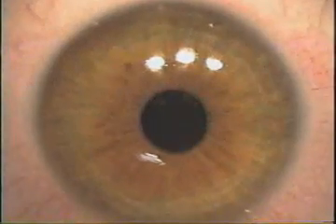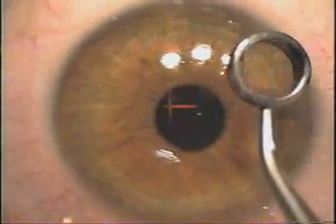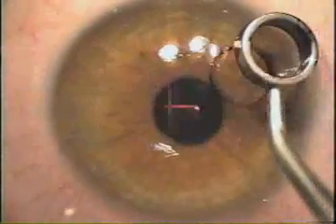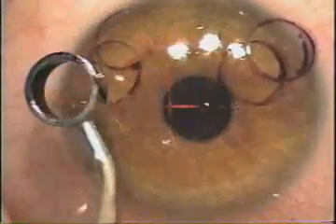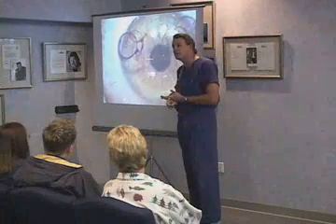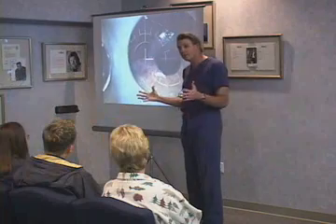Now the first thing we do, and the sound's probably not going to work very well, he doesn't see any of this targeting system. He just sees that blinking light. I'm going to make some little marks on the front of his eye with a washable ink marker. He loves to flick around a little bit. And the reason we do that is twofold. One, I said, Kevin, you feel any of this? And he said, no. And two, I've got 5 little half circles to realign that flap with when we get through, okay?